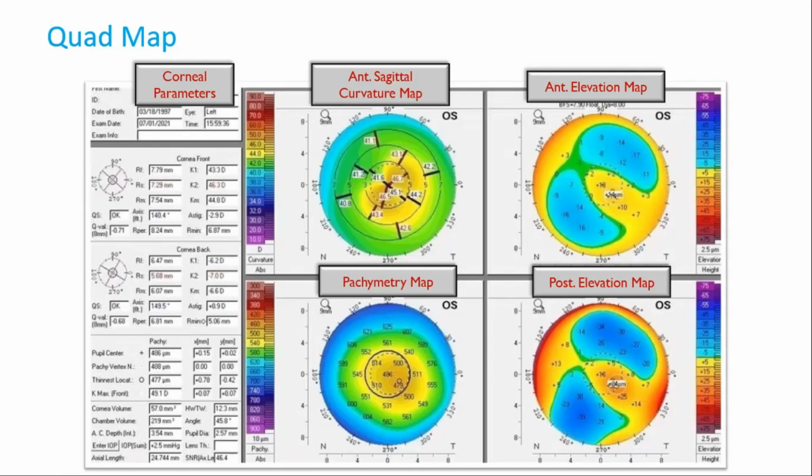So would you know what the limits of the keratometries are that a Placido map can capture? Sir, it is around starting from 20, I remember. I'm not sure, but it cannot capture very flat corneas. So can you check on this tomorrow and tell us, standard topographers, for example, Atlas or Oculus, what is the range of keratometry that they can capture?